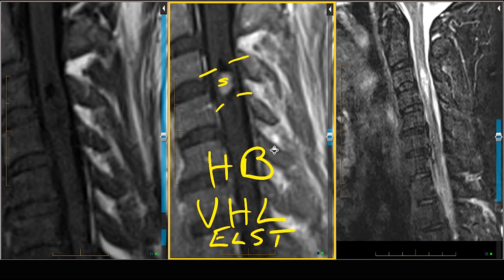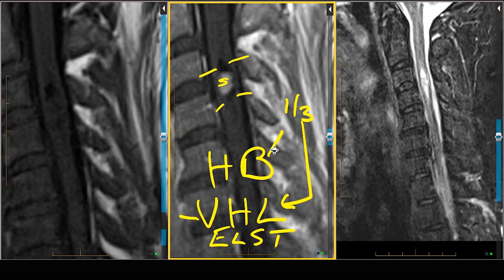With hemangioblastoma, one-third of patients who have spinal cord hemangioblastomas have von Hippel-Lindau disease, and one-third of patients who have von Hippel-Lindau disease have a spinal hemangioblastoma.